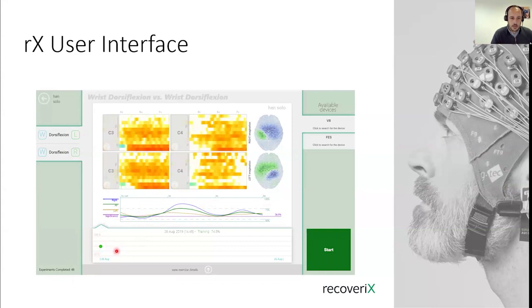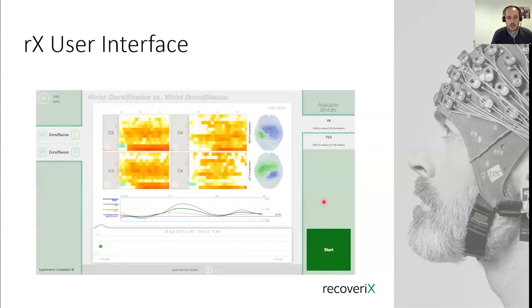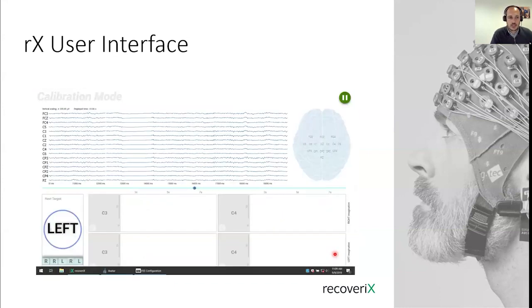In the lower part, we have the history of the patient. For example, this patient only came 1 time before. Here we have the virtual reality activation button and the FES calibration button. This is the FES setup window. As I explained, for the frequency we always take 50 Hertz. The pulse width for the upper extremity is 300 microseconds, for the lower extremity 400. Then we adjust the current for each patient. Then we go again to the main window, and we can start the session.